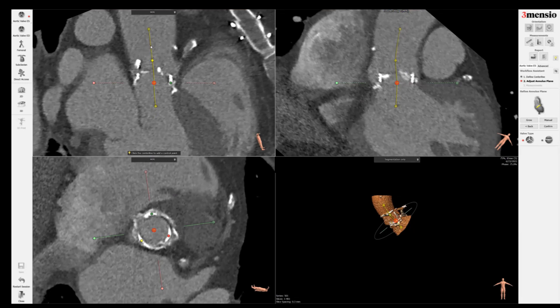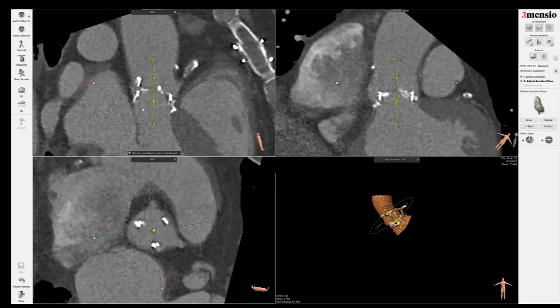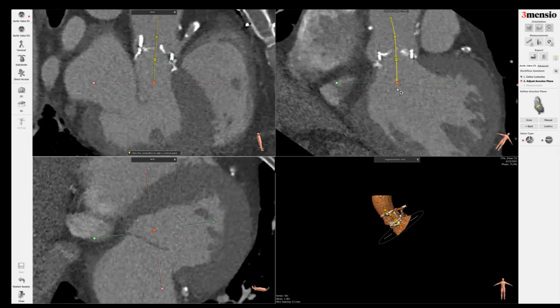Rather than doing the centerline completely all the way to the ascending aorta, I just do a centerline to the surgical valve portion only, up to the sinus tubular junction. I'm a little bit off with my dots, because your three dots should be equal distance and disappear at the same time — so you can see now that's pretty good. For the LVOT, you want to keep it relatively straight.